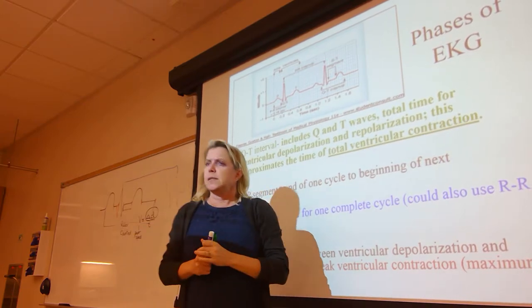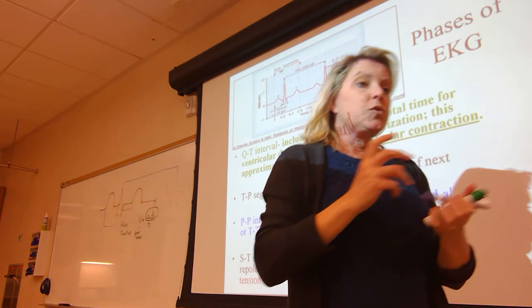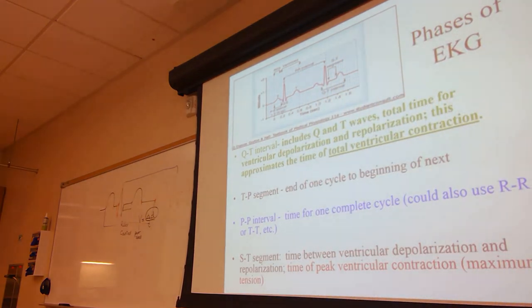That represents the time for the ventricles to depolarize and repolarize. That's the importance of the QT interval.